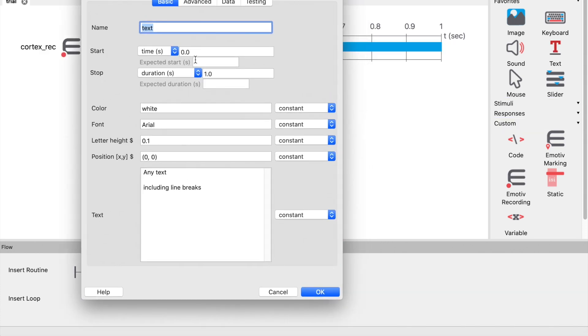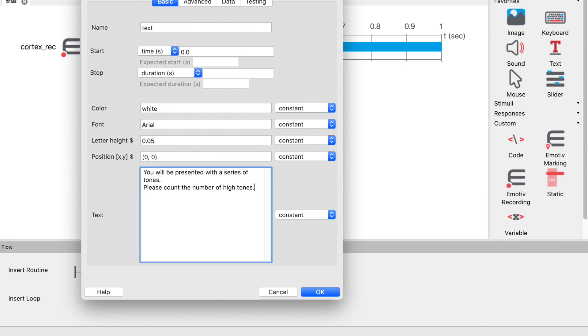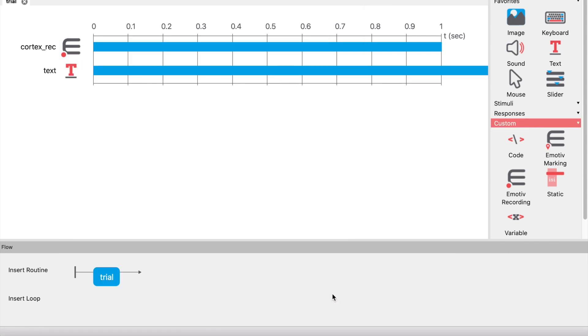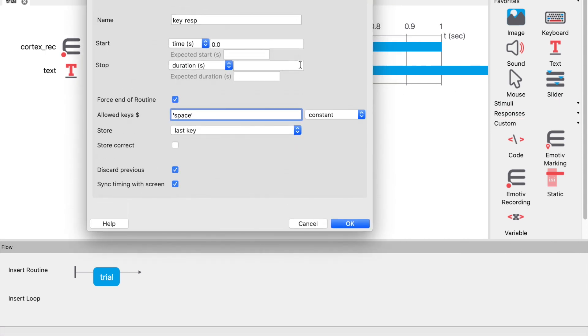Now let's add some instructions. Add a text component: You will be presented with a series of tones. Please count the number of high tones. Click space to continue. Then we will add a keyboard component to end the routine, ensuring the force end of routine checkbox is checked.